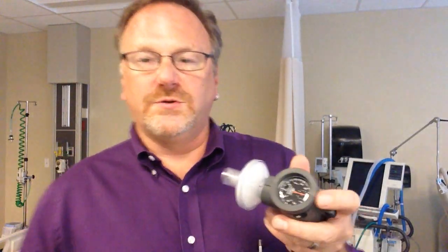So since my ideal body weight is 92 kilos, then I need to blow out on a slow vital capacity more than 920 cc's. That is the absolute minimum, 920 milliliters. If I could only do 800 milliliters, then you would want to start considering intubation, that I cannot breathe or ventilate myself.